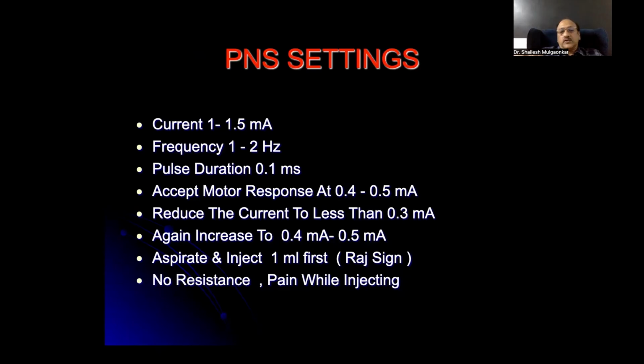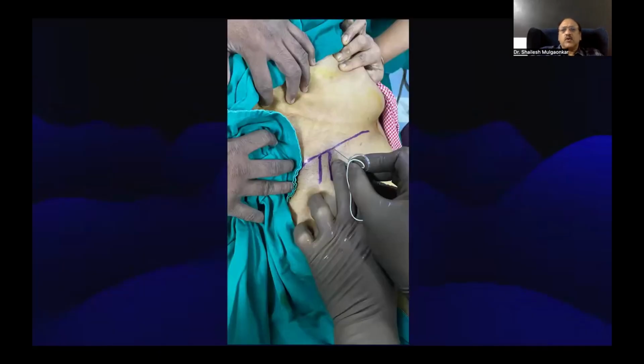Again, there should be no resistance while injecting, and the patient should not get pain while injecting. That's why, as far as possible, don't sedate the patient if the patient is cooperative. Don't give general anesthesia to the patient and then give the block.